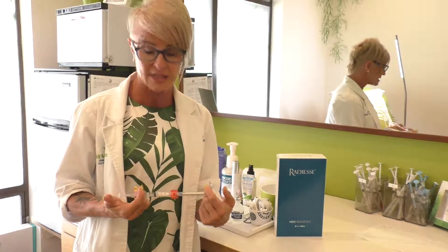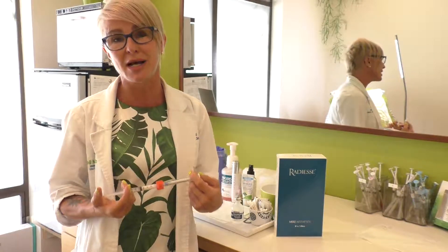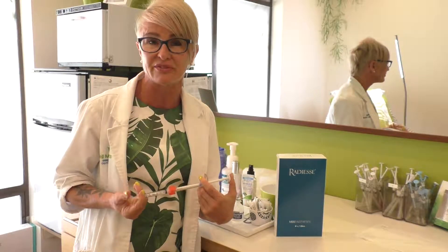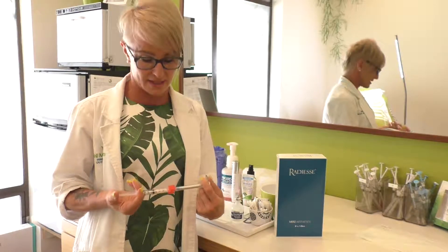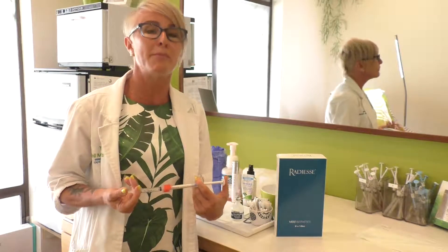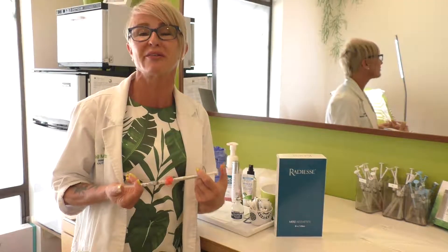After mixing in that small amount of lidocaine, you end up with about 1.8mls — nearly double compared to some 0.8ml syringes of other fillers. It's a great workhorse that gives you a lot of lift for very little filler. It's one of my favorites for the cheeks and temples, and especially for someone on a limited budget who wants more lift with fewer syringes. Radiesse is a wonderful choice.